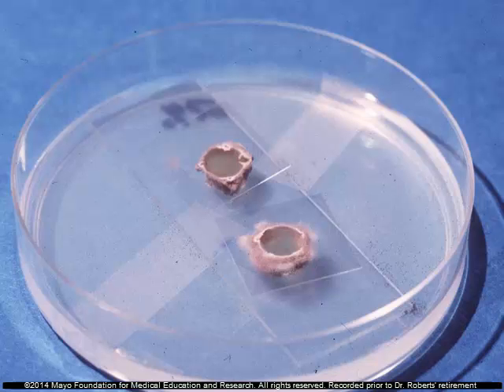And as it grows, it produces spores just the way it does in the culture, but they'll be underneath that cover slip. And when you think the culture is mature, you can remove the cover slip, put it on a slide with some lactophenol blue, and look at it underneath a microscope. And you probably will see the spores just as they have been produced underneath that cover slip.